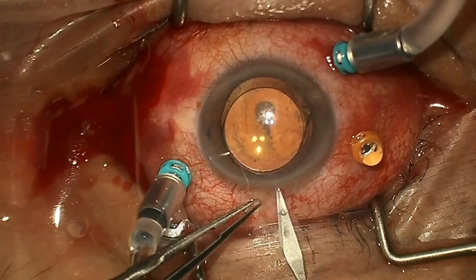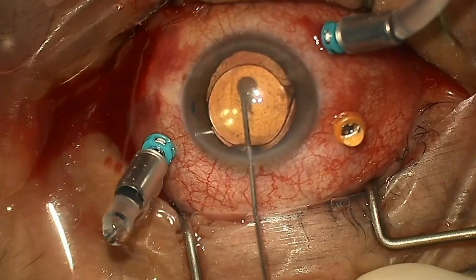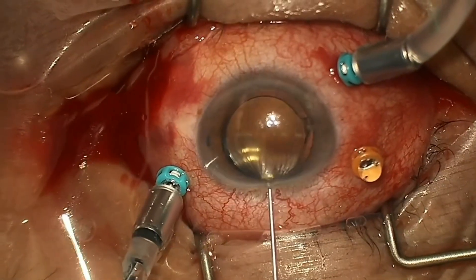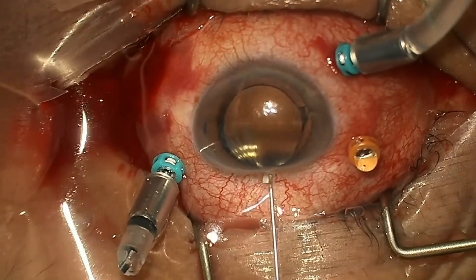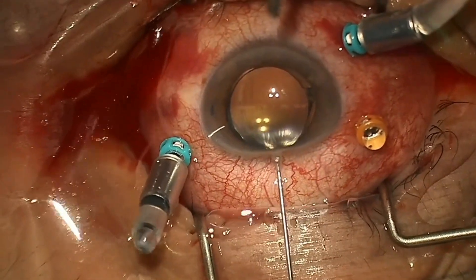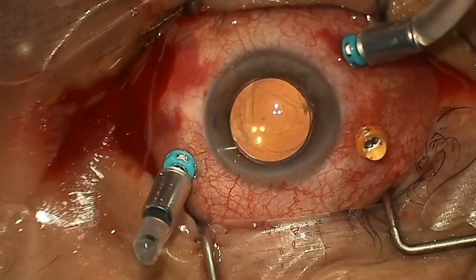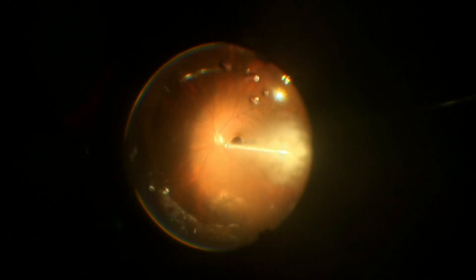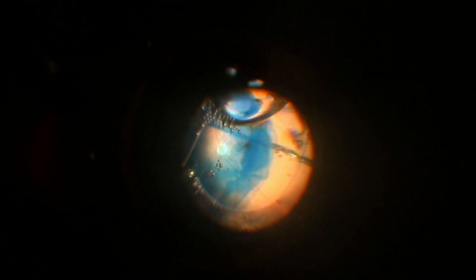If I know what oil went in there, sometimes I'll do 25-gauge. But if I don't know, I'll assume it might be 5,000-centistoke oil and good luck getting that out with 25-gauge. So I assume it's the heavier oil, put in a 23-gauge, and that really helps speed up the surgery. Doing multiple air-fluid exchanges, as we're seeing done here, really just gets rid of any residual oil particles and oil slick.